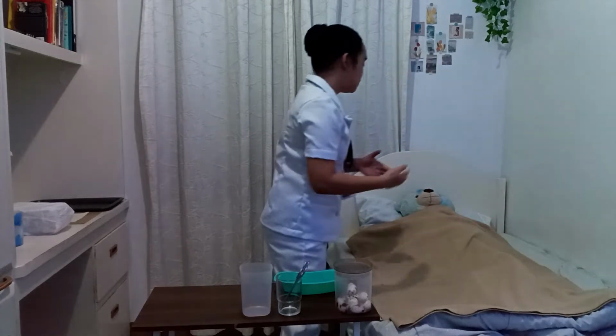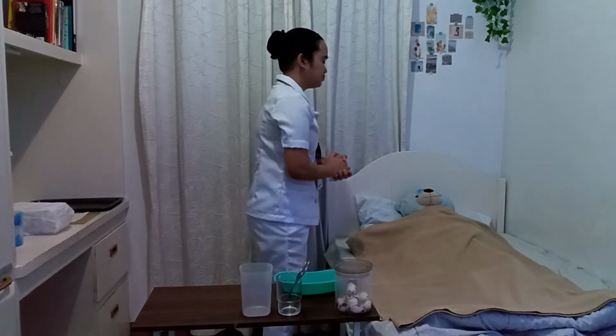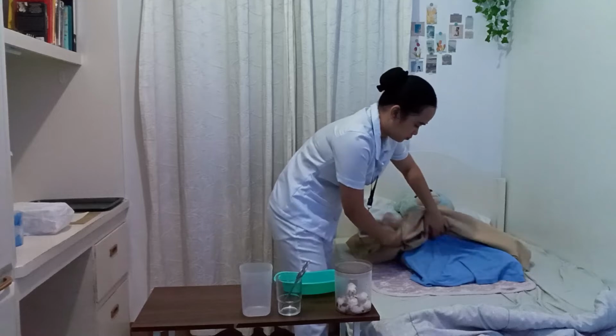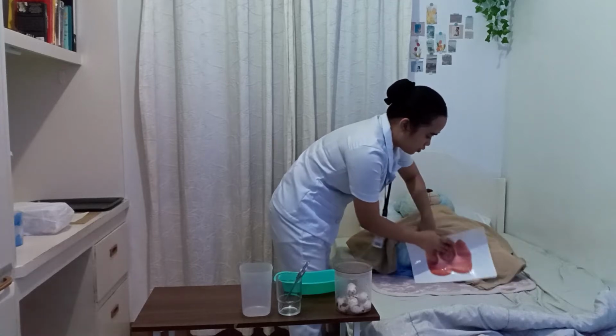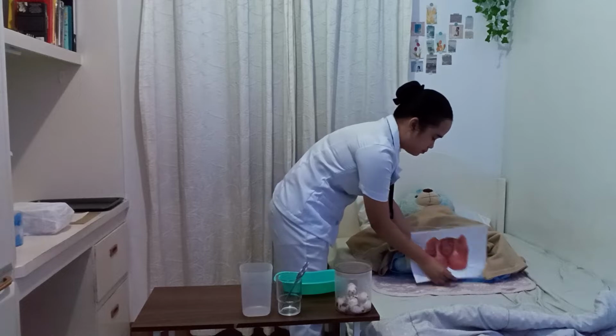Okay, so now ma'am, I'm going now to expose your genital area, okay? Right. So always remember to expose only the areas to be used and cover those areas that are not going to be used.